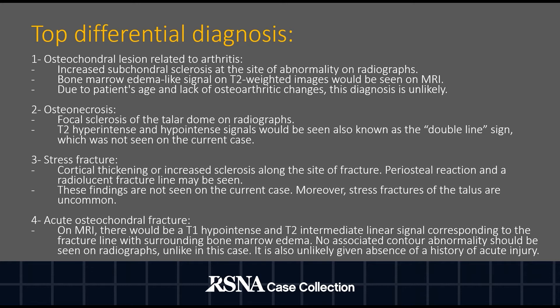For osteonecrosis, we should expect focal sclerosis of the talar dome on the radiographs. On T2-weighted imaging, linear high-intensity signals are seen adjacent to low-intensity areas indicating sclerotic bone. This is known as the double-line sign, and these findings are not seen on the current case.